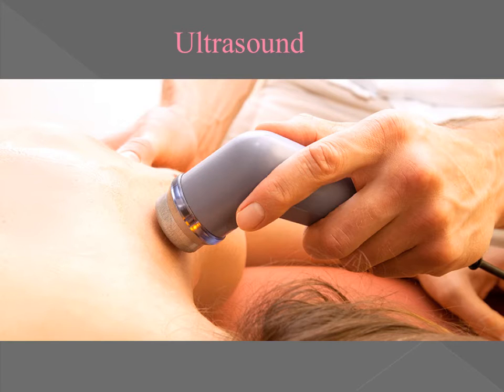The other deep penetrating modality that we don't talk about a whole bunch is diathermy. The other modalities within the thermo and cryotherapy unit were superficial, either cold or heating modalities, right? And so this will be the first one that is capable of penetrating deep enough to some of our target tissues to cause physiological changes, right?